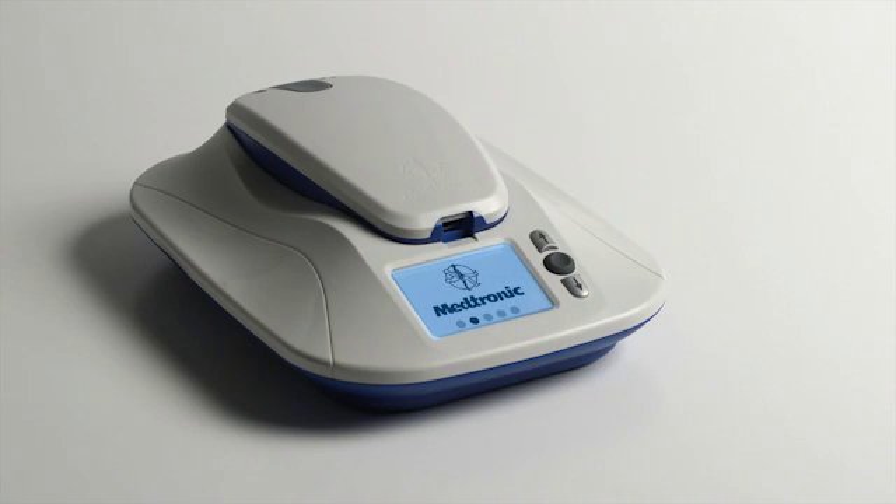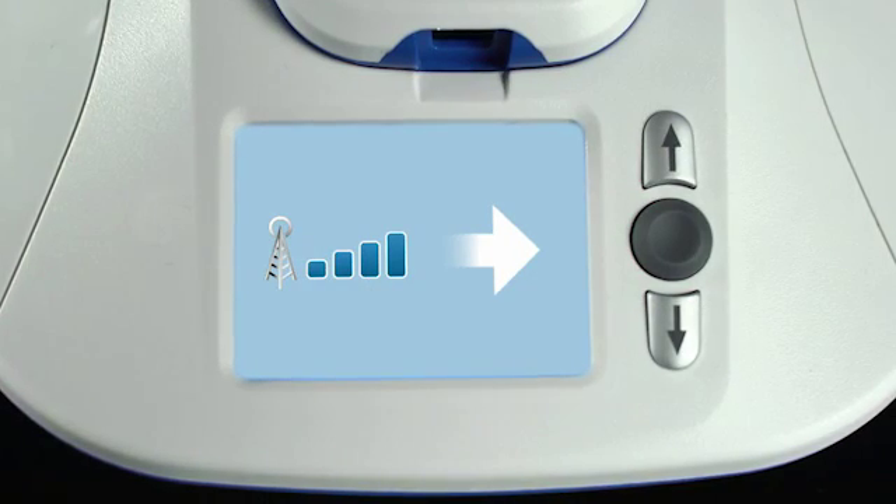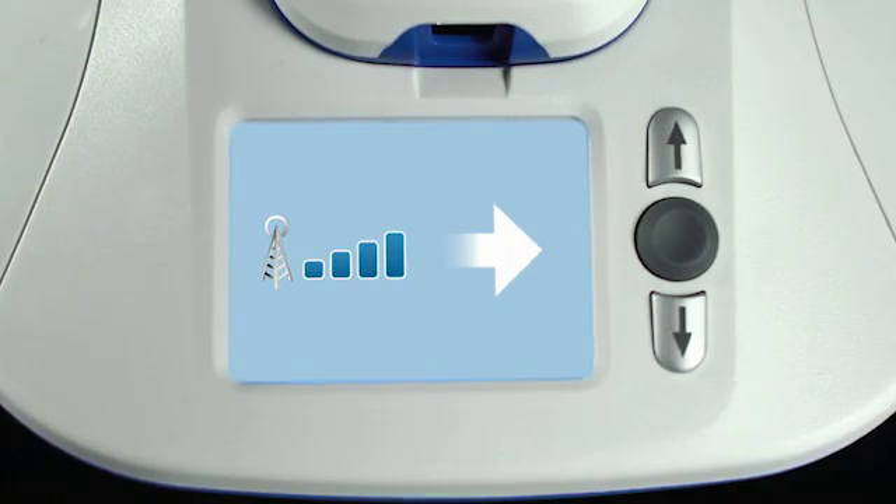After you plug in the monitor, the Medtronic logo will appear for a minute or two while it powers on. Then you should see an icon which indicates the monitor is connected to a cellular network. Although the MyCareLink monitor will automatically send your heart data on a regular basis, a single manual transmission is needed as part of the initial setup process. This setup transmission is needed only once — even if you unplug the monitor later to move it or take it on a trip, you won't have to perform another setup transmission. After setup, you should leave the monitor undisturbed as much as possible to avoid interrupting any automatic transmissions or software updates.